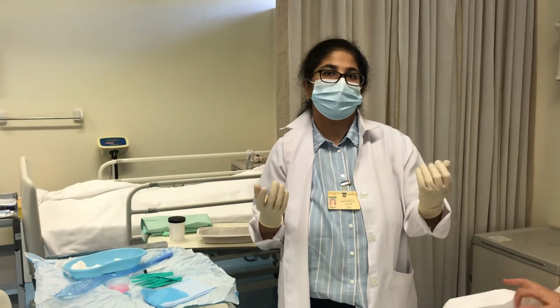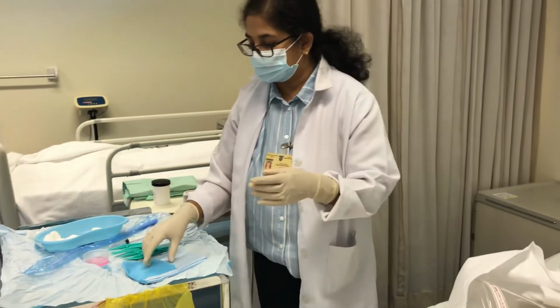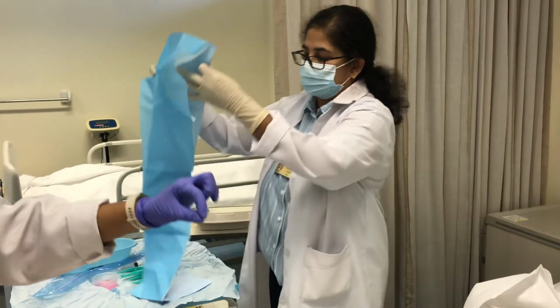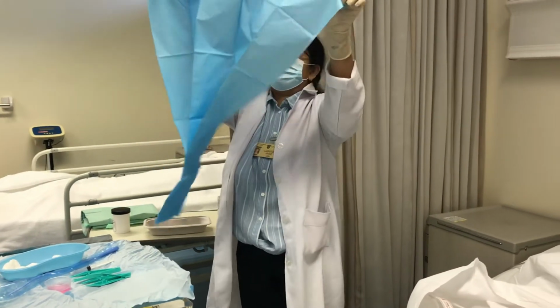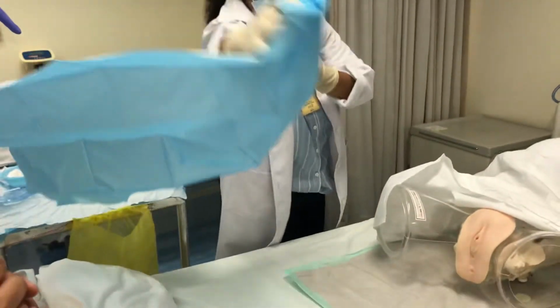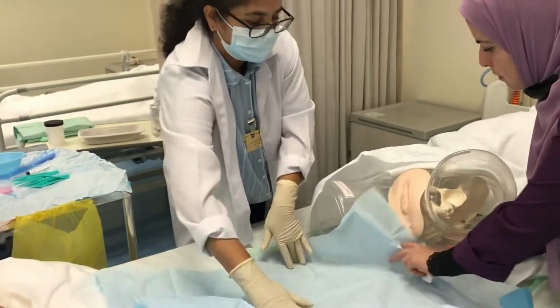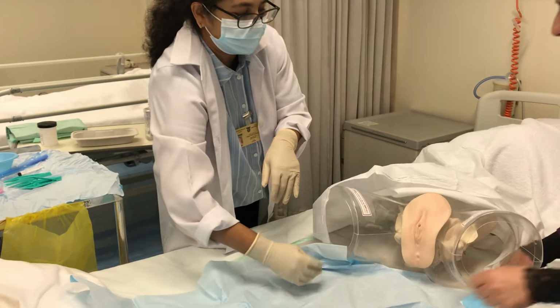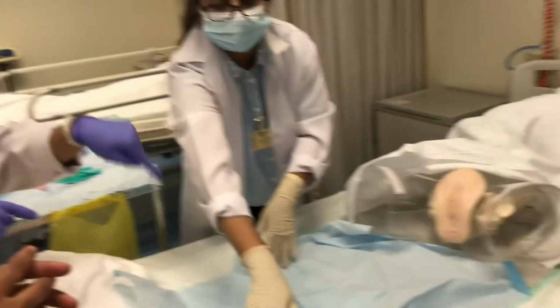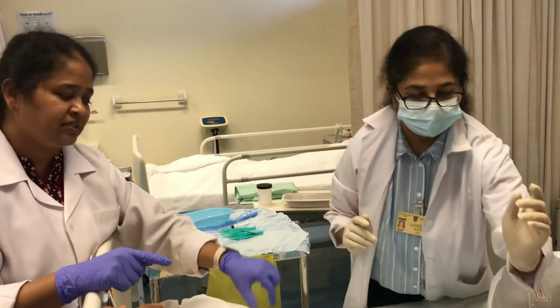important is my one hand will be unsterile, the other hand will be sterile. Once I start the procedure, because she is going to touch the urinary meatus, separate the labia and all those things, her left hand will become unsterile. In a hospital setting, we have a fenestrated towel. Fenestrated means there is a hole in the central middle, like a central hole towel. Ideally, there is a hole in the middle. We put it there and only the hole we can see.